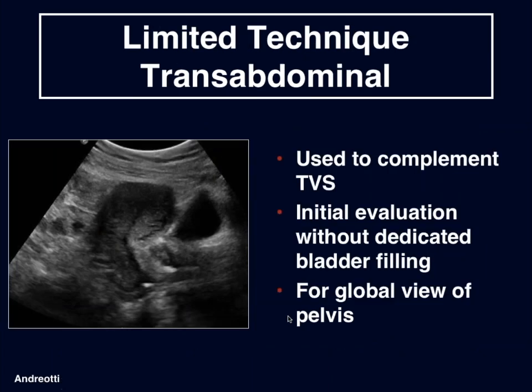So a limited transabdominal technique may also be used to complement transvaginal sonography. And this would be an initial evaluation using transabdominal sonography without dedicated bladder filling, which has been found to be very useful to see a global view of the pelvis before performing a more detailed transvaginal examination.